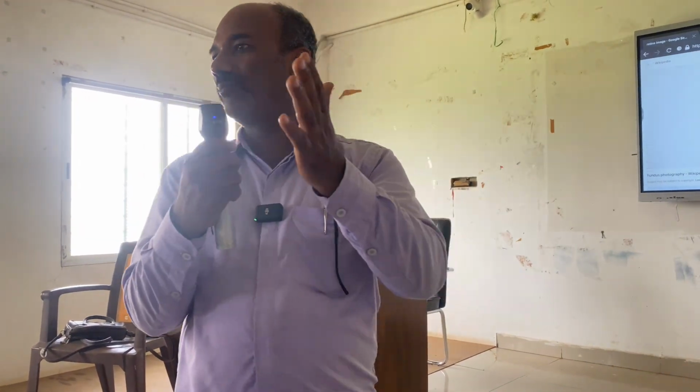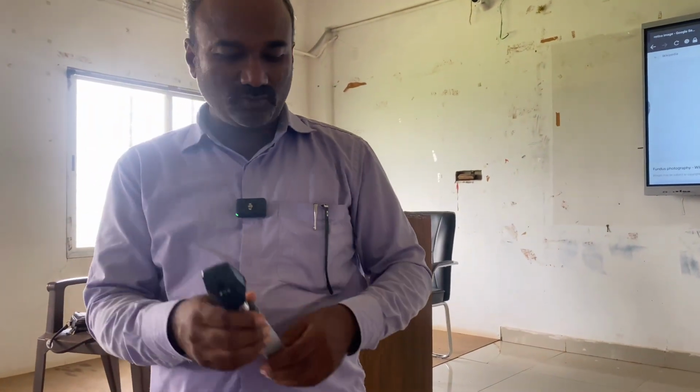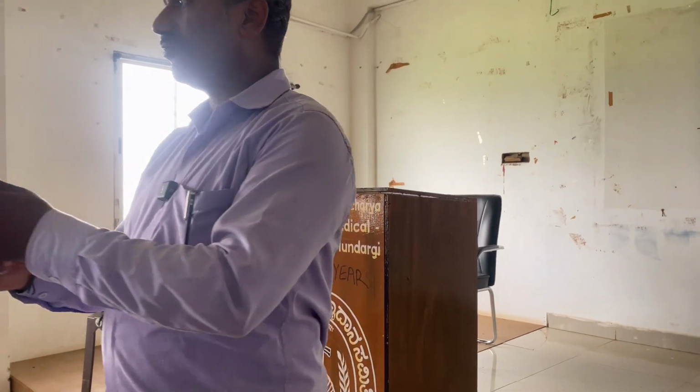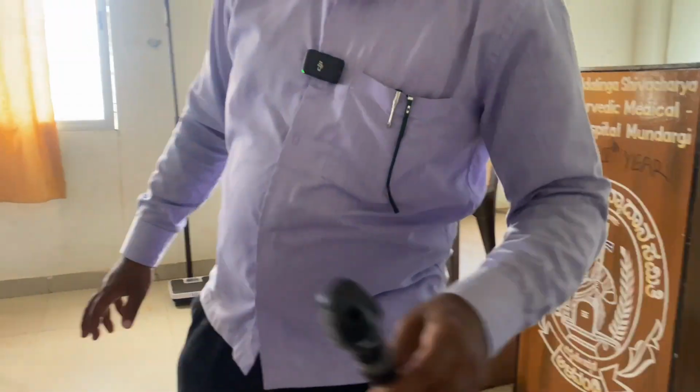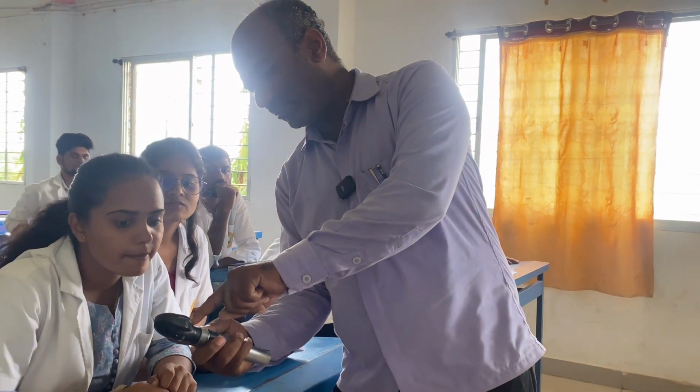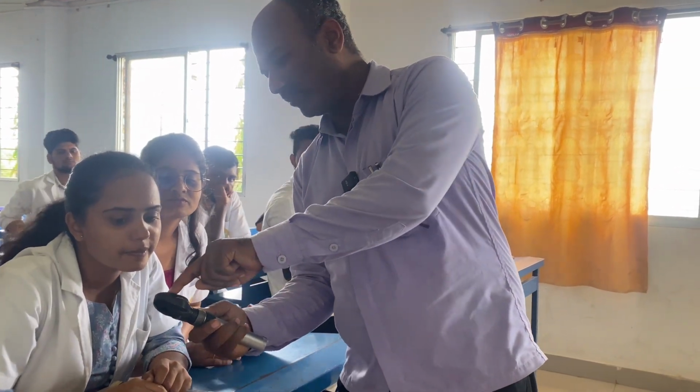And this is the cobalt blue filter. So this ophthalmoscope can be used for the examination of the anterior segment even, right? There are two types. Now first you learn how to hold this, how I told, likewise you hold this. Lens indicator, right? Viewing window.